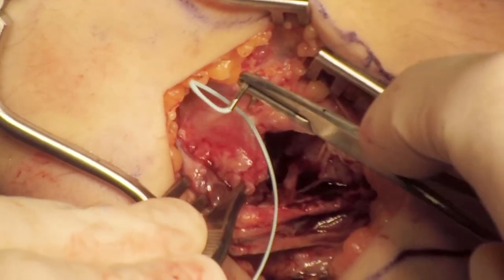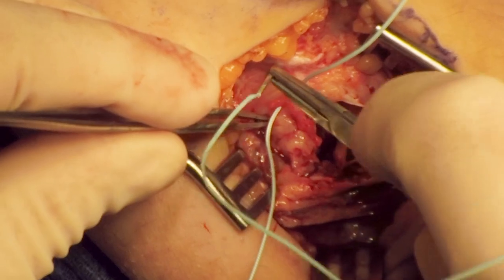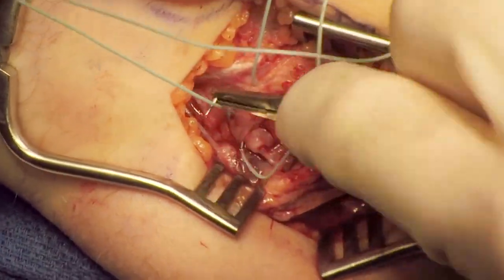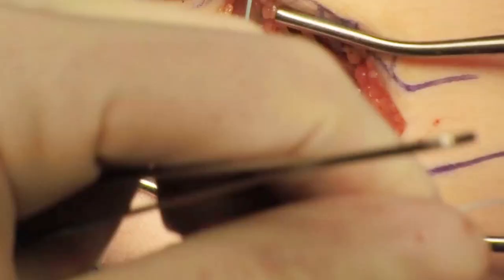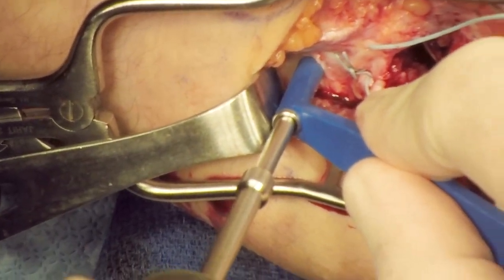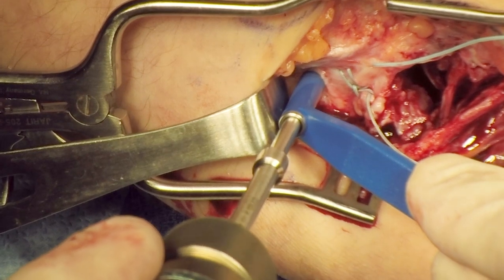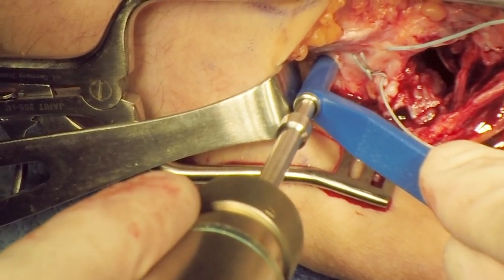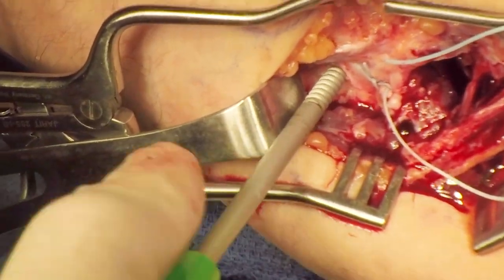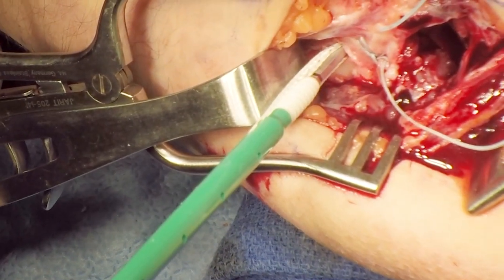A number two FiberWire suture is placed in a running locking configuration in the LCL. A drill hole is placed just posterior to the insertion of the LCL on the supinator crest. It's important to aim posteriorly so you don't skive the anterior cortex. I typically tap the hole, making passage of the anchor easier. I use an Arthrex 4.75 SwiveLock preloaded with a fiber tape. The anchor is inserted and deployed.